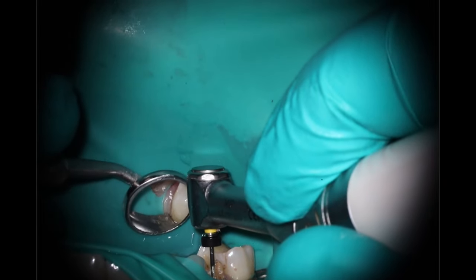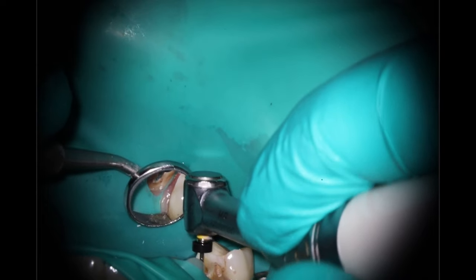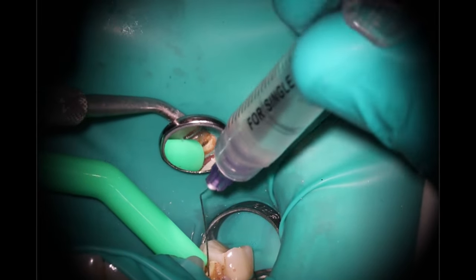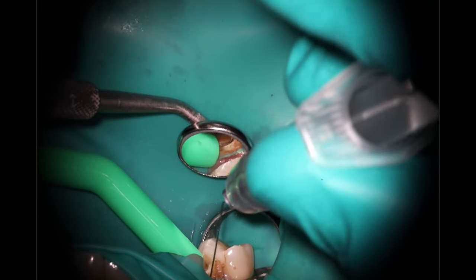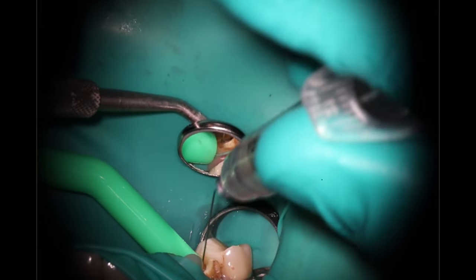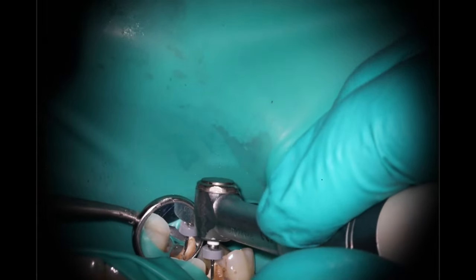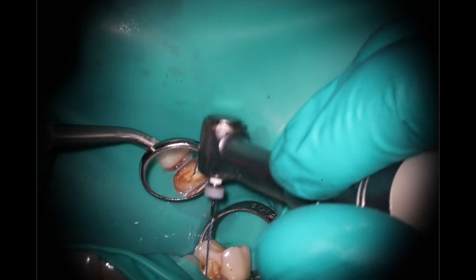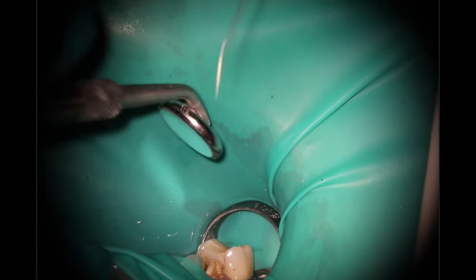I wasn't able to get all the way down here. Working length is 19.5, so I can just use the existing stoppers since they are 1.5 millimeters. I do miss one-millimeter stoppers — all the stoppers used to be a millimeter, now they're 1.5 on the rotaries, which is a little harder if you have a 20.5-millimeter tooth. Going back in a couple of times here because there's a lot of back and forth. You can usually feel that stick give way when you finally get patent — looking much better.